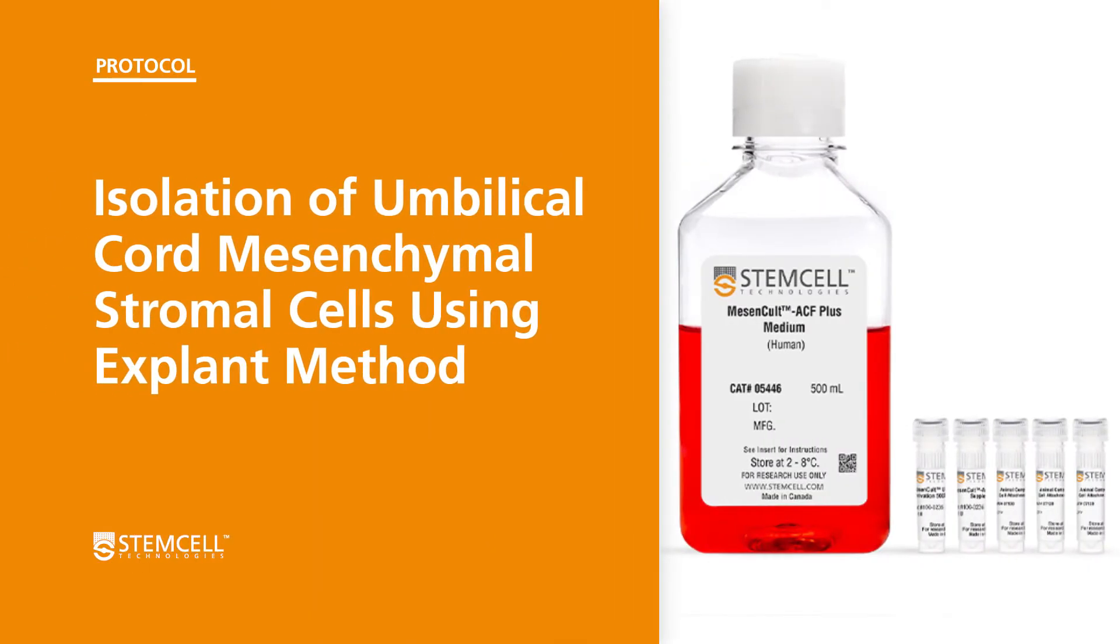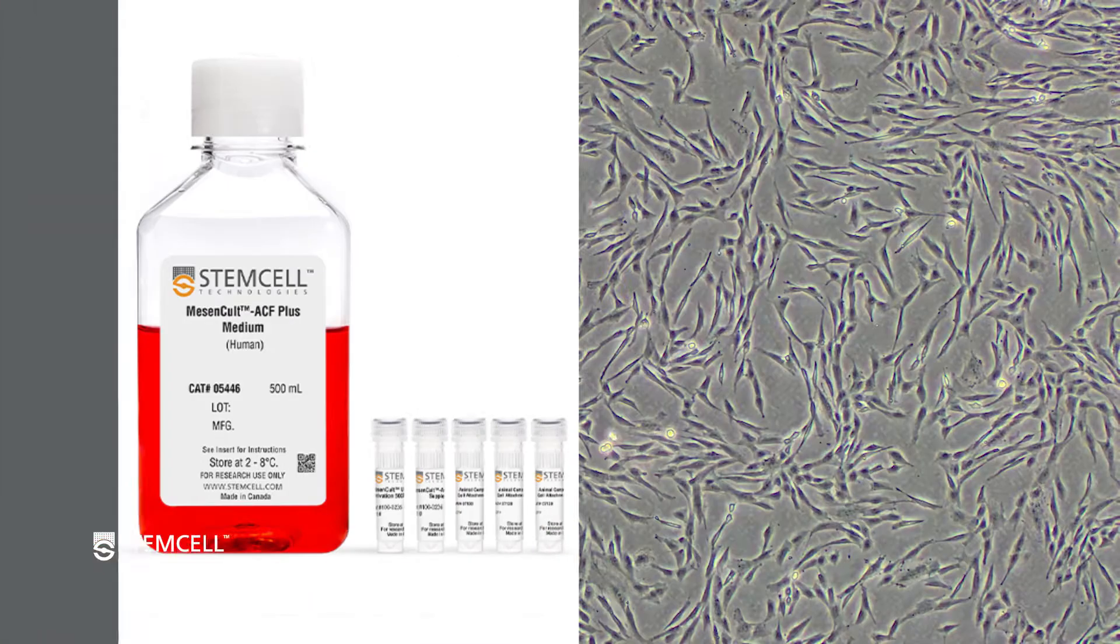In this technical video, we will guide you through the protocol for isolating mesenchymal stromal cells, also known as MSCs, from fresh human umbilical cord tissue using the explant method and the MesenCult ACF Plus Umbilical Cord Culture Kit. Following this step-by-step protocol will ensure that you are able to generate the highest yield of MSCs from your cord tissue sample.